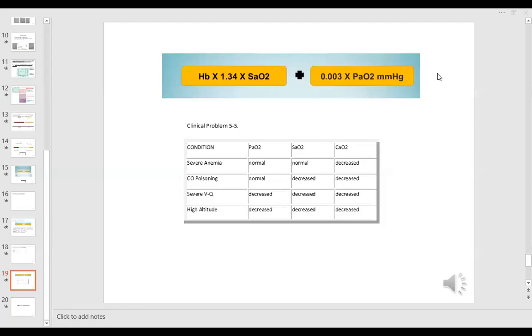So I just want to start this part of the lab with your page 142, I believe. If I'm wrong, please check it out. And we talked about some of these values like PO2 or PaO2, same thing. And then your SaO2 is your oxygen saturation and hemoglobin. So if you see SaO2, it's going to mean that we used an arterial blood gas. If you see SpO2, it's going to be the pulse oximeter or peripheral pulse.